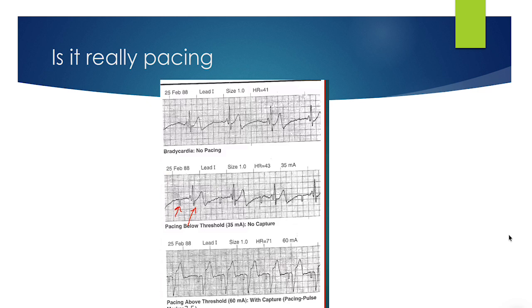So I have an example here of capturing, and I believe that capturing is usually the most problematic thing to do in the field. It is very easy to miss whether it is actually pacing or not. You're usually able to figure it out if you check the pulse and the pulse is not matching. But here's an example of pacing, then we'll see if it's capturing or not.